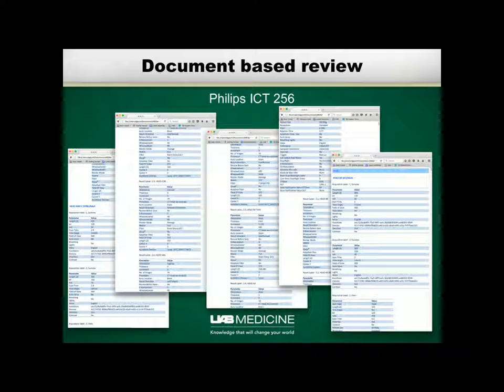And it's also true when you review, whether you review on the console or you're reviewing something like this, you're doing validation and verification at the same time, because you're actually validating what's on the scanner. You don't have to verify that it's been put there.